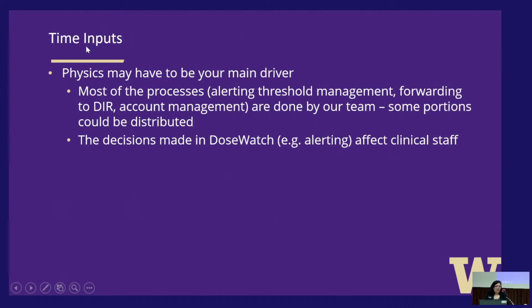Physics, at least for our site, is the main driver. We rule Dosewatch. If anyone wants access to Dosewatch, we are the ones who give it to them. Most of the processes, alerting, threshold management, forwarding to the dose index registry, account management, are all done by our team. Some portions could be distributed to IT, but since we know the system really well and what it's being used for, it's just easier for us to manage it. We still have to work with IT when we have to do upgrades because they're at a higher level, but most of it we do.